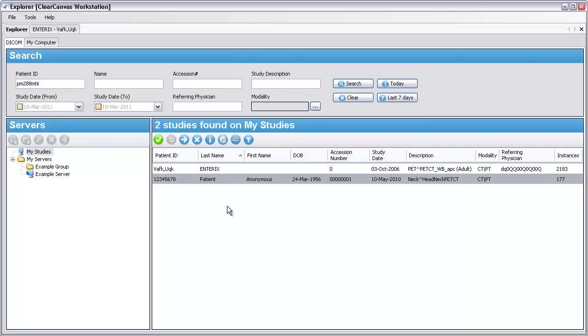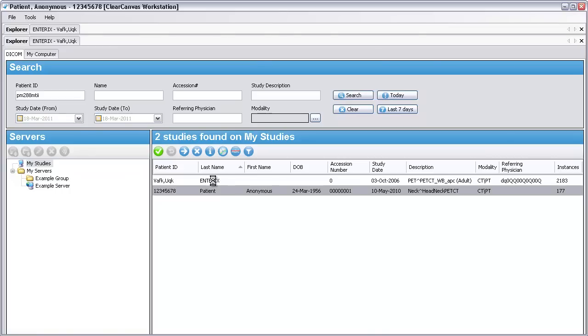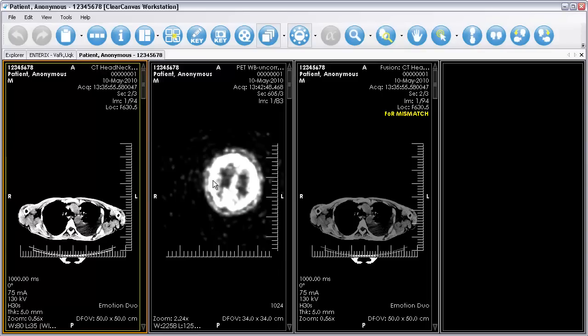PET-CT Fusion is applied automatically when opening a study containing valid combinations of PET and CT series, like this.